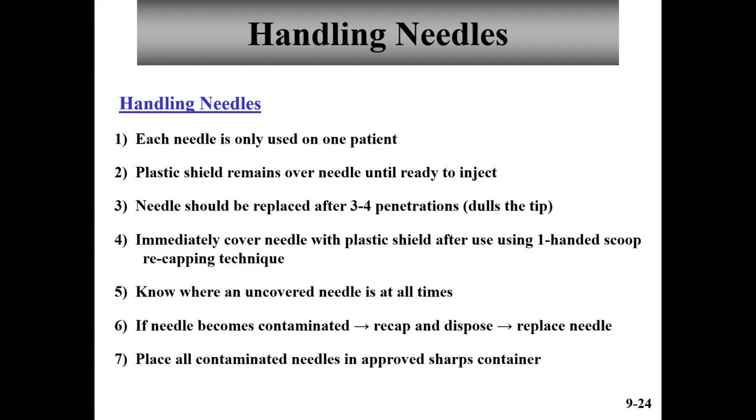You have to know where an uncovered needle is at all times, so make sure that you don't stick someone in the leg or in the arm or in the hand. Don't sling a needle around, a syringe around, if it's not covered. You shouldn't do that anyway. If the needle becomes contaminated, recap it and dispose of it and replace the needle.